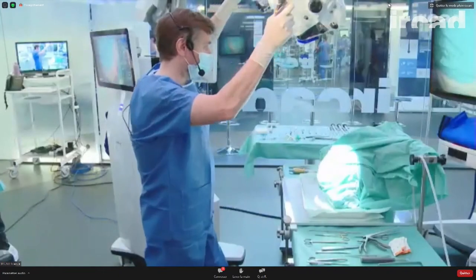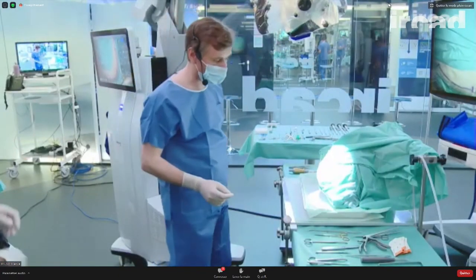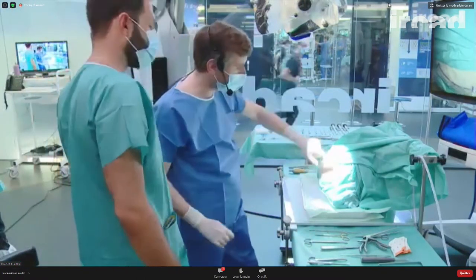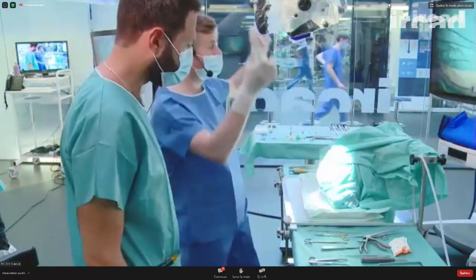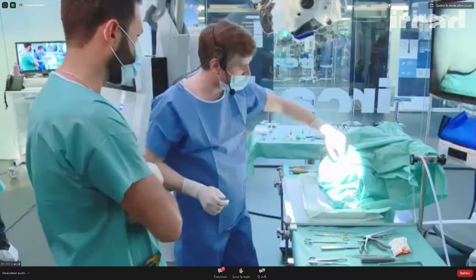So let's start with the demonstration. As I said yesterday, the incision has to go quite low for an FTOZ approach.